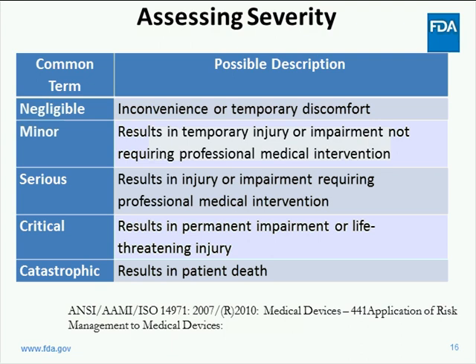Generally speaking, the severity of patient harm increases from minor and temporary and inconsequential to requiring medical intervention as well as death. While this is a suggested approach to fulfill the risk assessment regulatory obligation, the intent of the guidance is to align with current manufacturer processes. The terminology used by medical device manufacturers could be from already established risk assessment methodology.